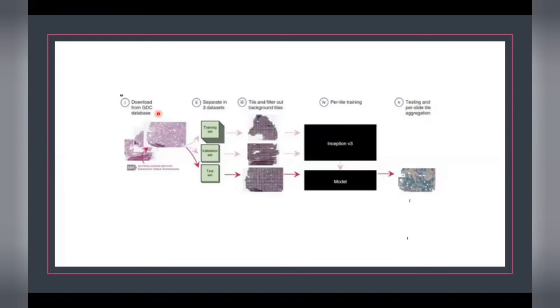Now this training set and validation set, when they are fed into an algorithm and the machine is told to bring out a prediction, it will bring out that this is the tumor area, this is the non-tumor area. And when you put in a test set, where the data is not labeled as tumor or non-tumor, it immediately comes back and tells you that this is the tumor area and this is not the tumor area, and gives out an imprint which looks like this. The tumor area is highlighted as blue, the non-tumor area is orange. So it can actually identify a tumor by training.